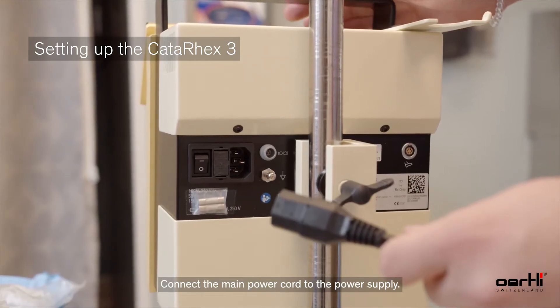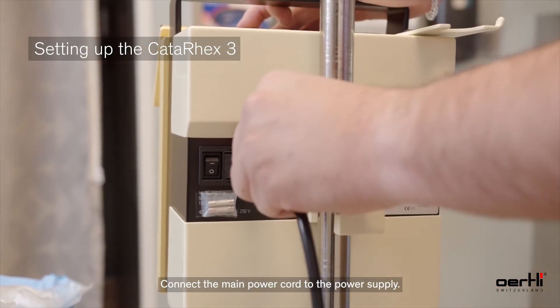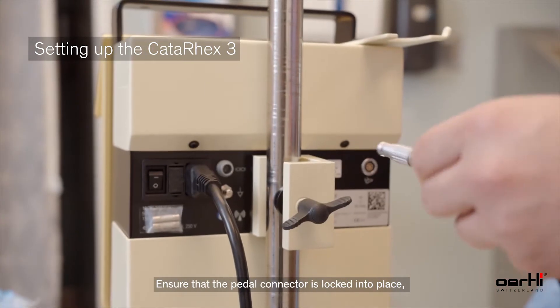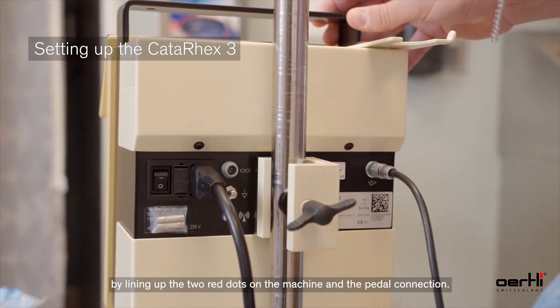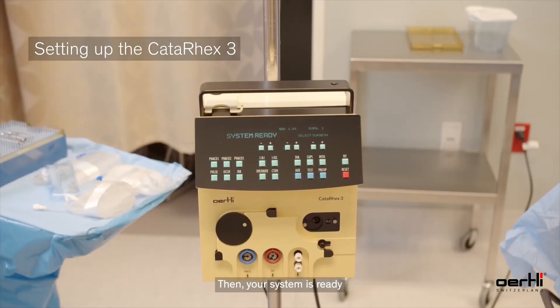Next, connect the main power cord to the power supply. Ensure that the pedal connector is locked into place by lining up the two red dots on the machine and the pedal connection. Then your system is ready.